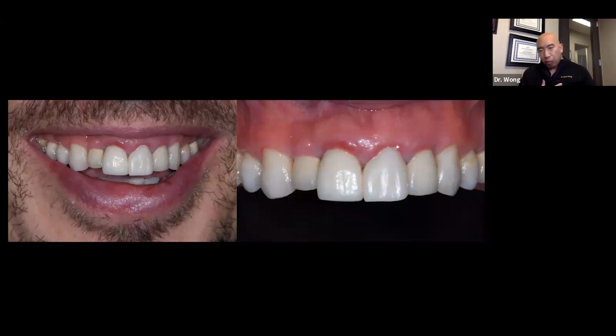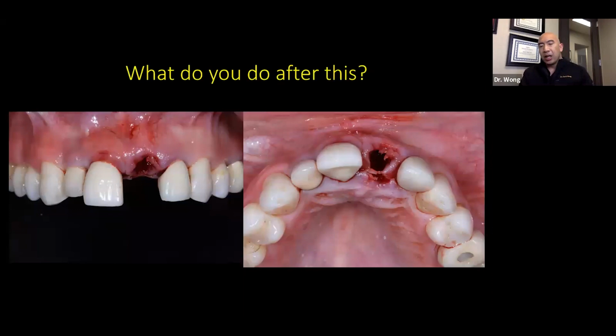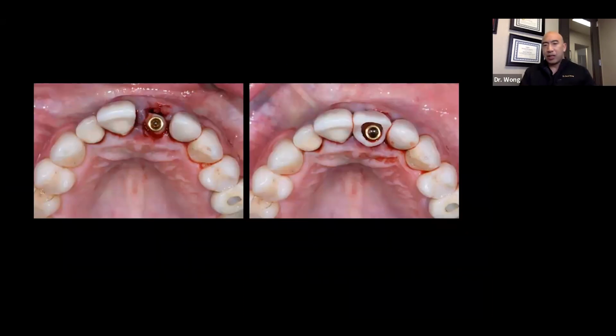So in my practice, being a periodontist, one of the most useful things that I do is implants. Single teeth is what I do most. So as an example, in a situation like this, we're going to replace tooth number 9. And I think a lot of people, when they learn implants, they get really excited about the possibility of placing an immediate implant.